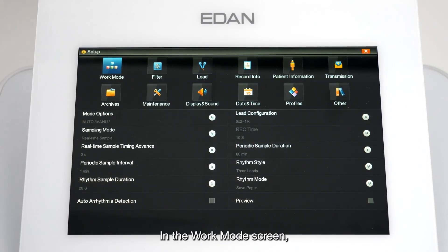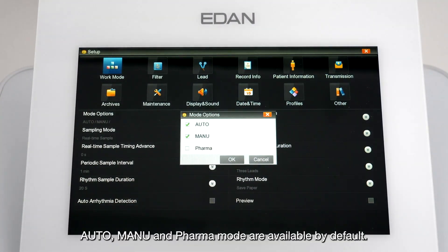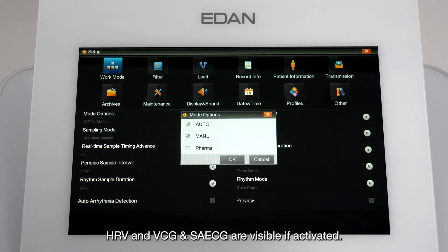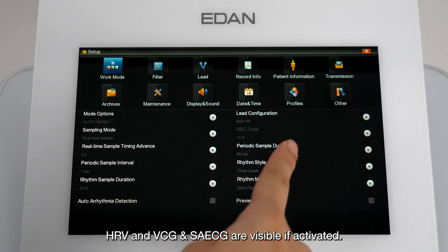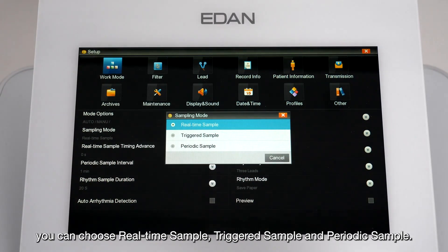In the work mode screen, tap the Mode Options button. Auto, Manual, and Pharma modes are available by default. In the sample mode interface, you can choose real-time sample, triggered sample, and periodic sample.